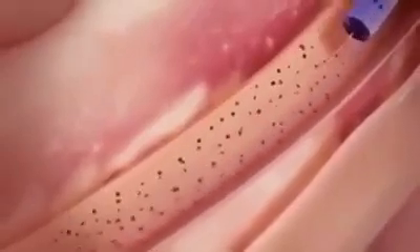Rapid removal of occlusive thrombus with vacuum extraction can accelerate door-to-balloon time and improve outcomes.